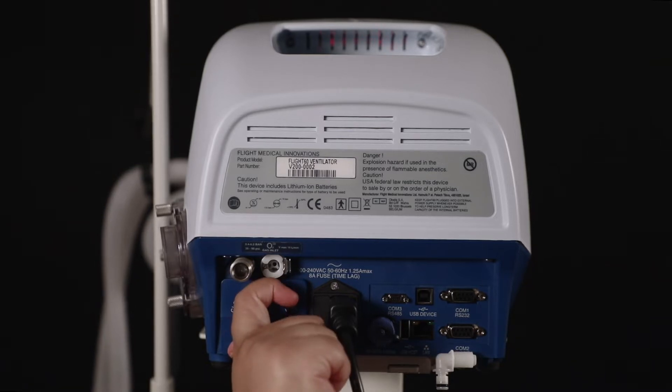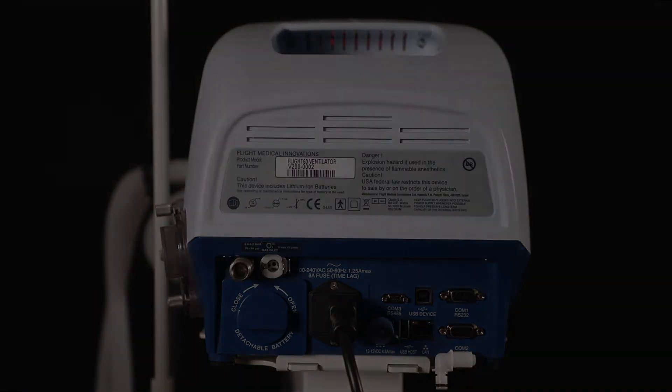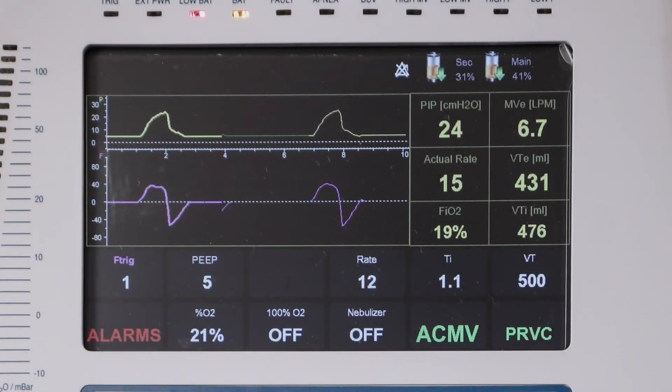Make sure to rotate it completely until you hear a click sound. On the top right of the screen, the two battery icons indicate the battery capacity. The real-time battery capacity is displayed in numerical percentages.